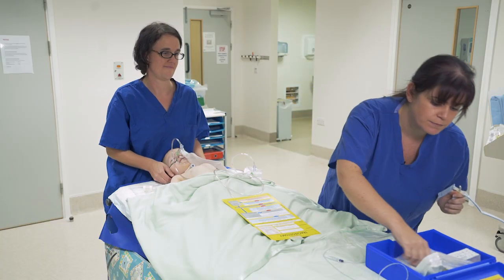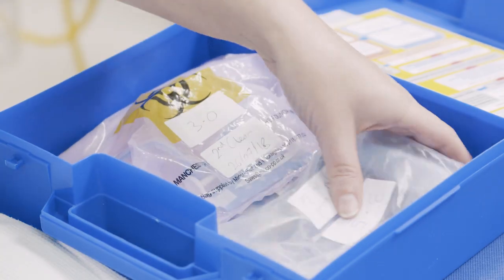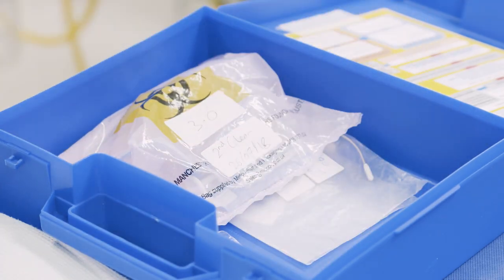Every child with a tracheostomy will have an emergency box. The tubes are kept in here, ready to use in an emergency. They'll be either in a clean bag or in the box that the tracheostomy comes in.